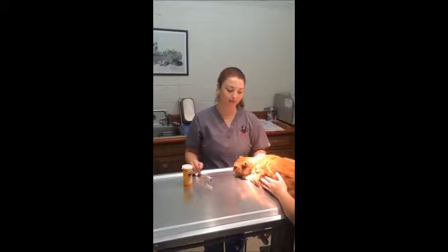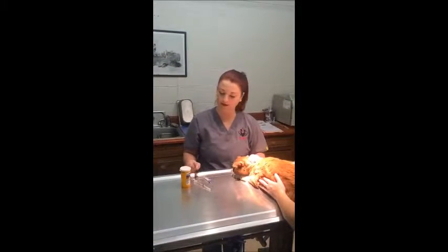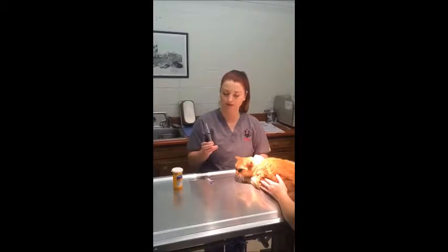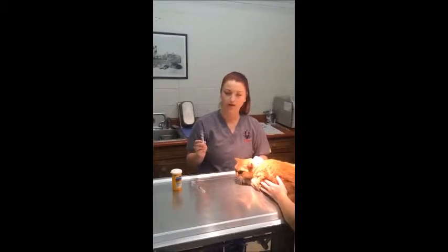My name is Ashley Mays, and today I'm going to be doing a jugular venipuncture on a feline. I've got my alcohol swab, my 3ml syringe, and I'm going to go ahead and break the seal. And then I've got my correctly labeled tube.